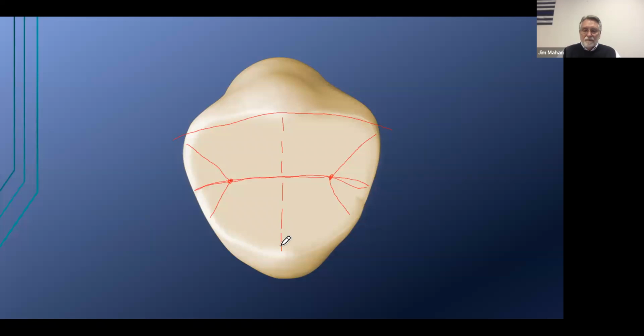Now I have the crest of the ridge here. This secondary groove is going to be a curving groove. It was a little bit sloppy, but I want to make sure we get through the teeth that I want to show you. Now, right here is midway between the crest of the ridge and the adjacent groove. So there's about midway, there's about midway. I'll put a curving groove here. And notice on this secondary groove, I mostly go from the pit, I mostly go out, in, and out.